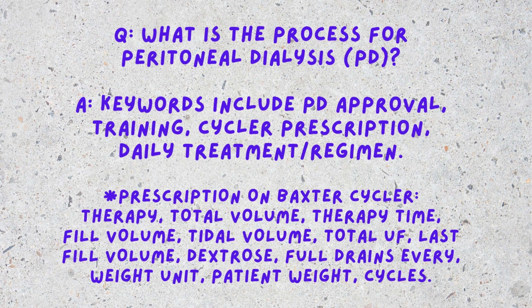So the training is usually two-pronged: at the clinic and then also at your home. At the clinic, of course, you will come in and they already have the protocol in place, teaching you what machine you are going to be operating, the supplies you will be needing, the company you will be ordering from. For example, Baxter, ordering your inventory.